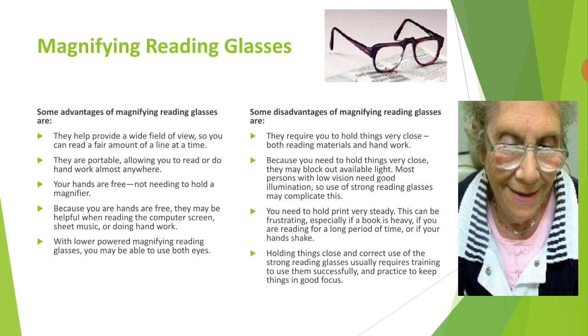Because your hands are free, they may be helpful when reading the computer screen, sheet music, or doing handwork. With a lower power magnifying reading glasses, you may be able to use both eyes.